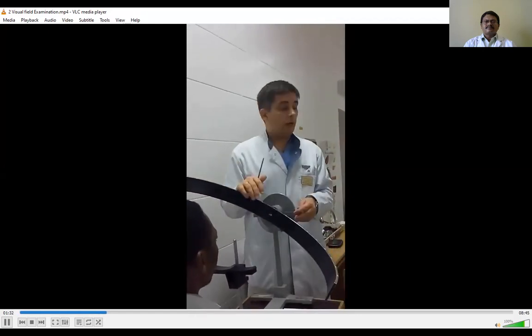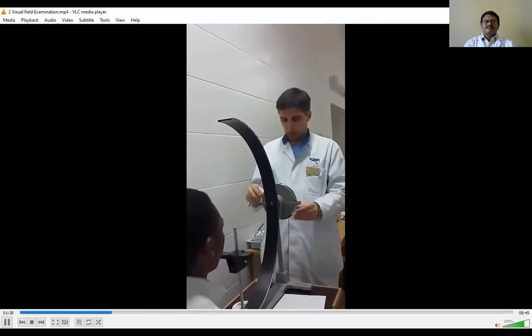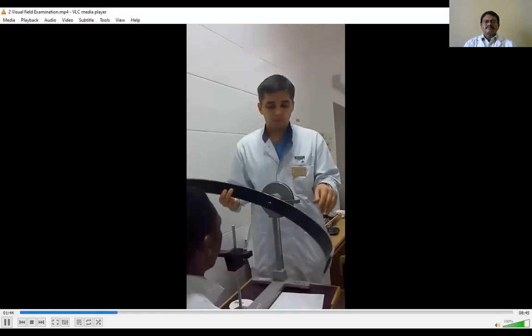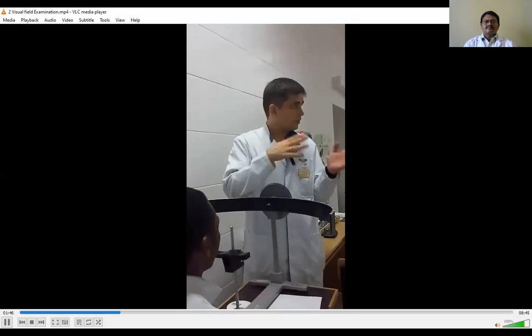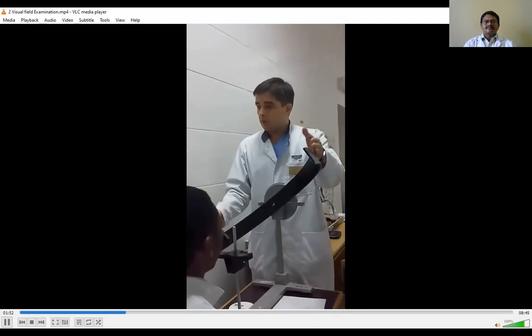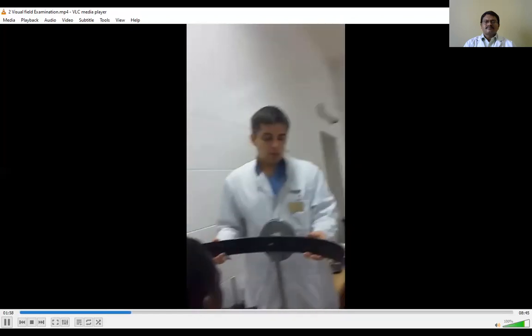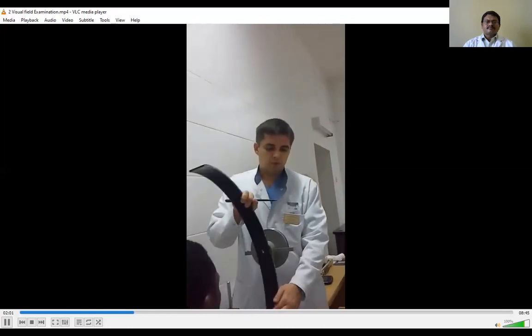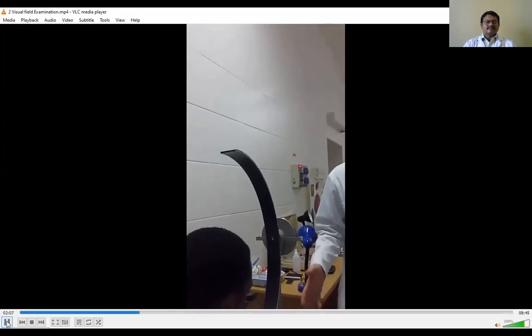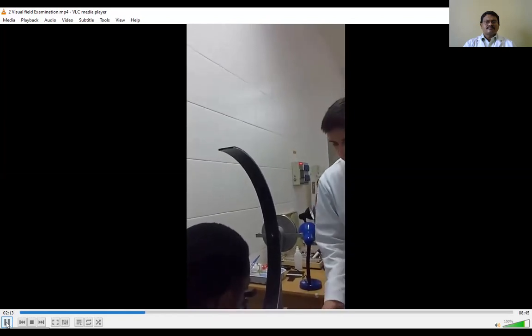When you measure in 8 meridians, 8 will be enough. What do 8 main meridians mean? 8 main directions. So, superior border, inferior border, two lateral borders, nasal and temporal, and 4 oblique ones. For example, superior temporal, inferior nasal, superior nasal, inferior temporal. It doesn't matter from what direction of the arc you start, it may be the horizontal meridian, maybe vertical, it doesn't matter. Also, we check both eyes separately. Before you examine, during the credit and for your practice, before you start, you should draw such a simple picture of the main meridians.